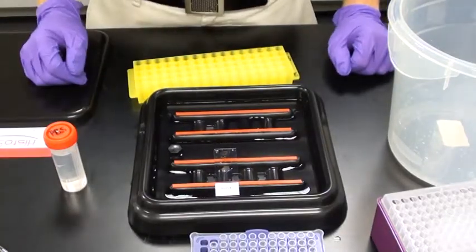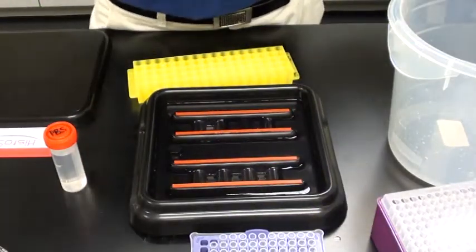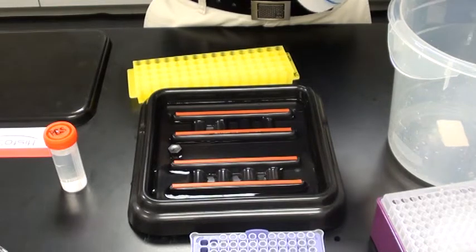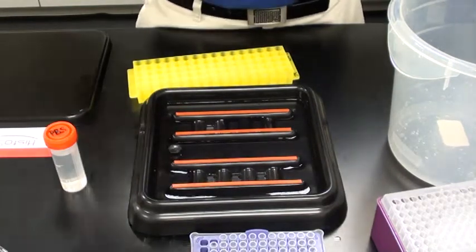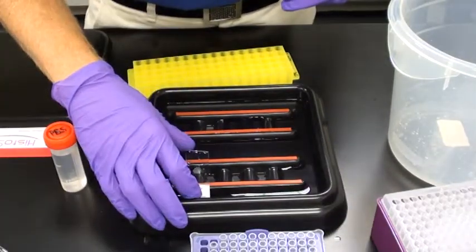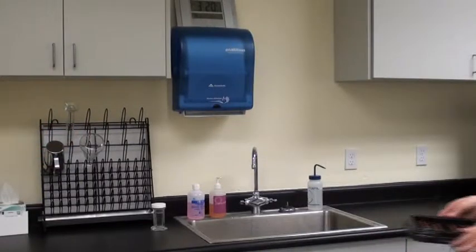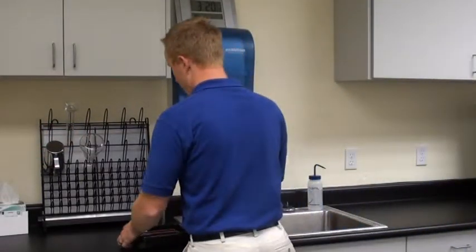Once the DAB is developed to your satisfaction, we're simply going to rinse it off and begin to counter stain. Once you've rinsed off the DAB, it's time to counter stain with hematoxylin.